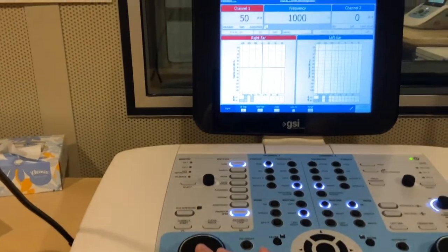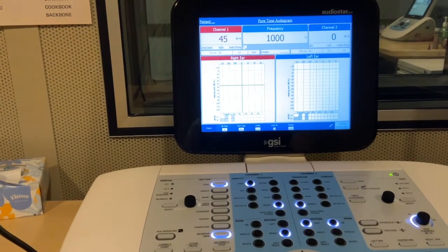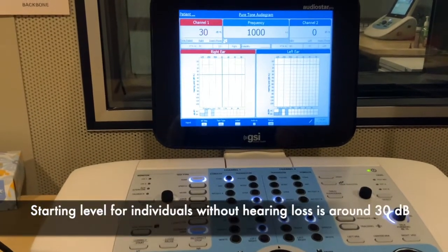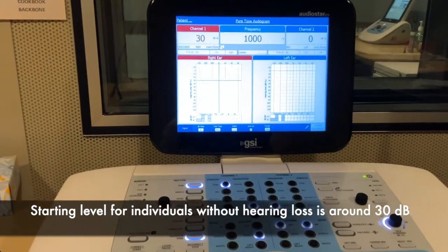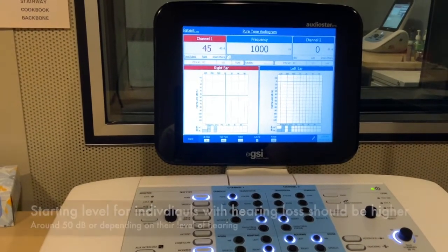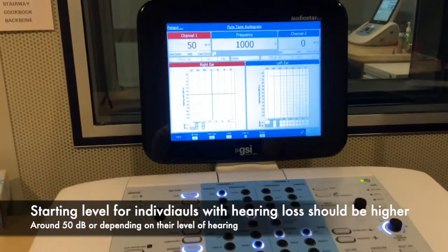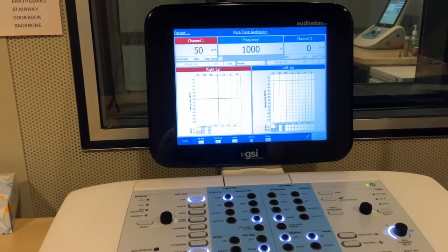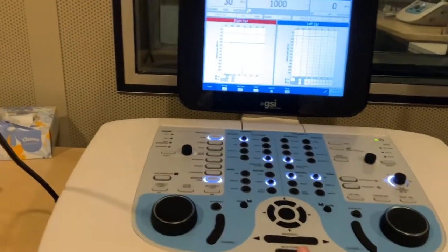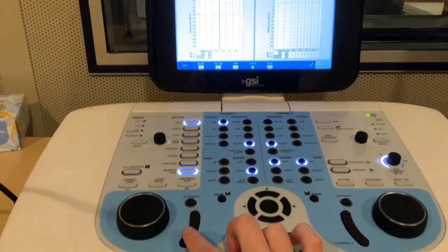The starting level that we want to use for individuals with normal hearing thresholds will be around 30 decibels. In someone that you know to have a hearing loss, you will start a little bit higher, maybe around 50 decibels or even more, depending on their level of hearing that you're aware of, but we'll start right now at 30 dB. And so the way I'll present this is I'm going to hit this button here.